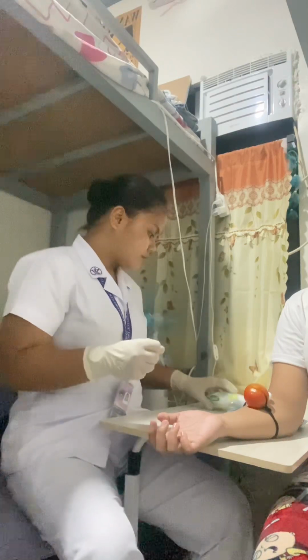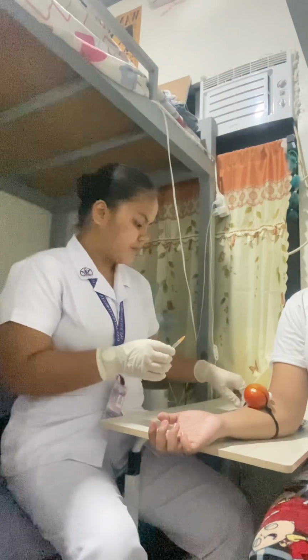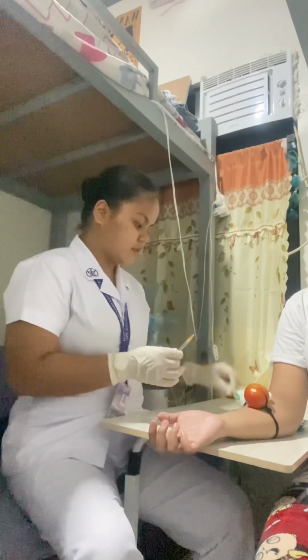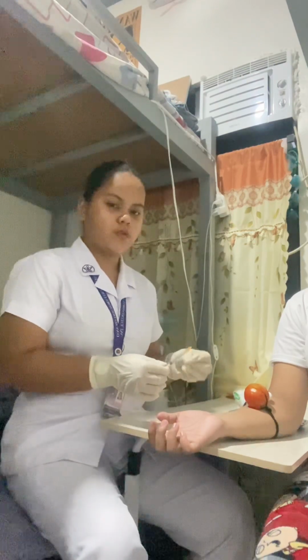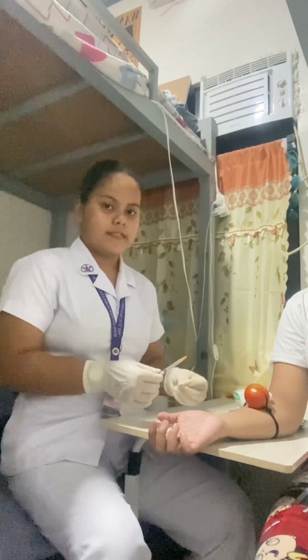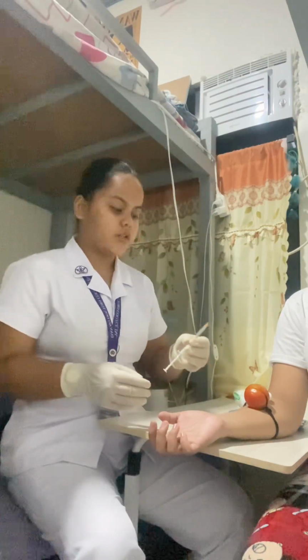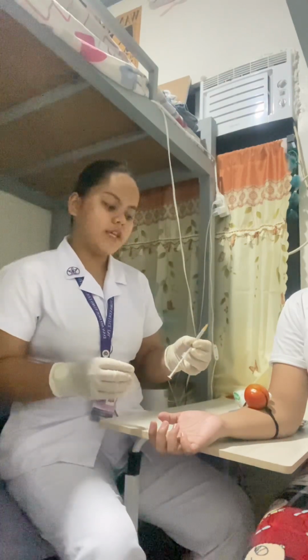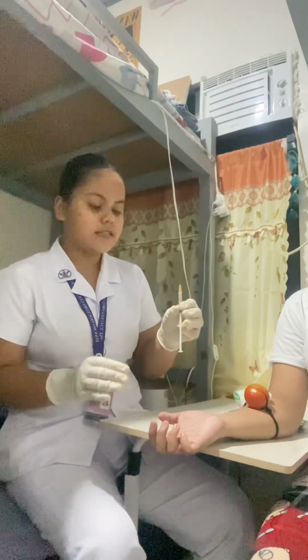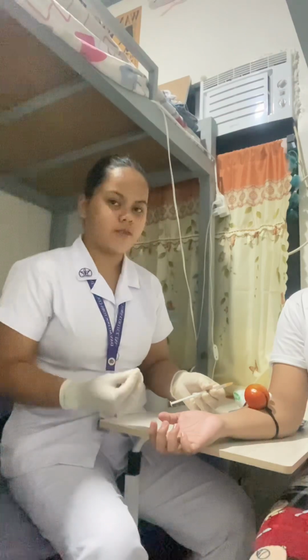After that, I am now going to prepare the syringe, remove the cap, and discard, remove the needle and put the needle aside. So we have to make sure to avoid contaminating the syringe so that it is kept sterile before injecting it into the client. So now I am going to grasp the syringe with my dominant hand, using my thumb and my fingers like this, and then position it at a 45-degree angle.